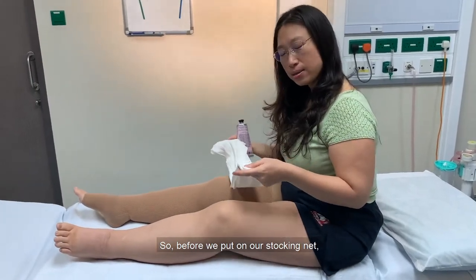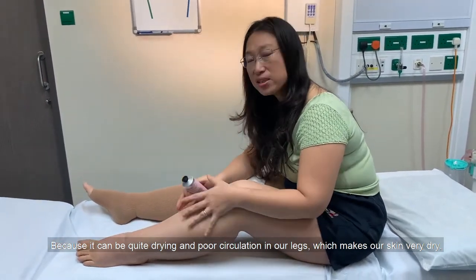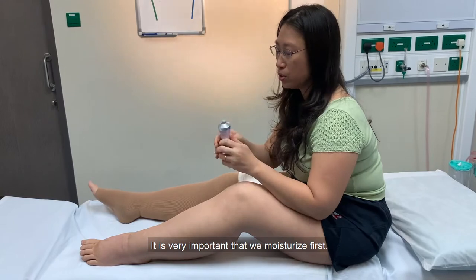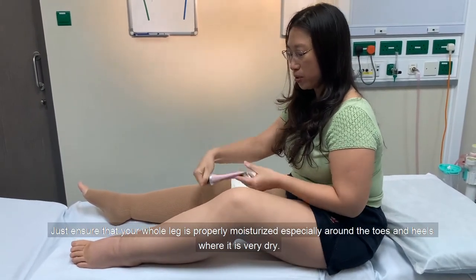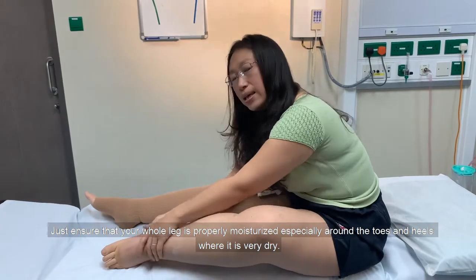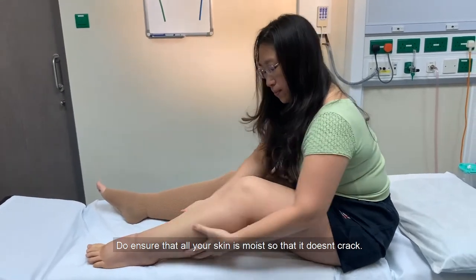Before we put on our stocking net, because it can be quite drying and because of poor circulation in our legs which makes our skin very dry, it is very important that we moisturise first. Any type of moisturiser will do. Just ensure that your whole leg is properly moisturised, especially around the toes and heels where it is very dry. Do ensure that all your skin is moist so that it doesn't crack.